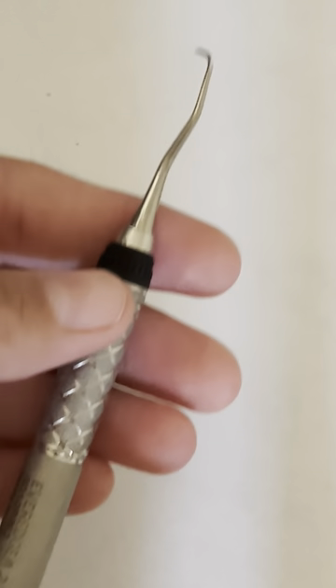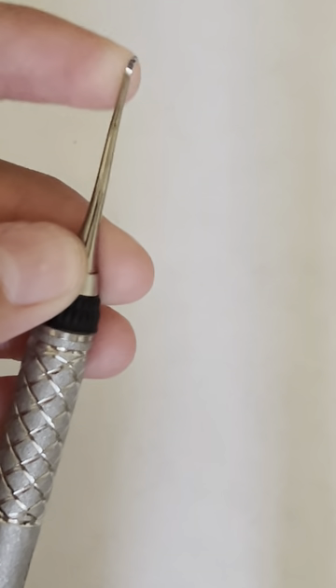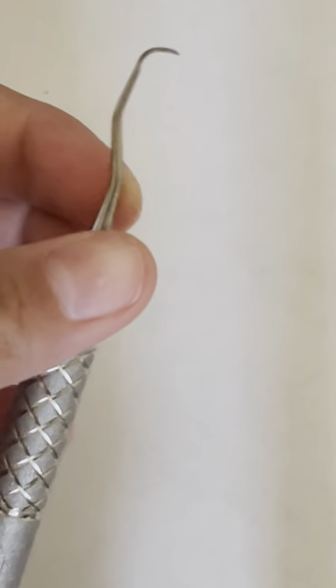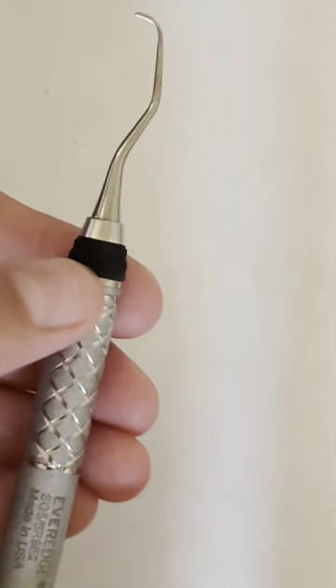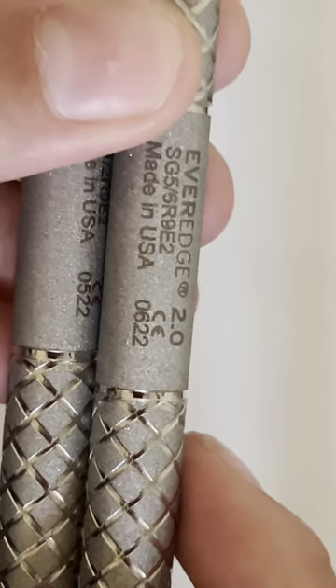Those are the universal ones. Then we're going to do our curettes — these are the specific area ones. We're going to start with our Gracey 1/2, putting it first because it's simple and for anterior teeth. Then I'm going to go to my Gracey 5/6, which is also for anterior teeth. We can see the G5/6 label here to compare.